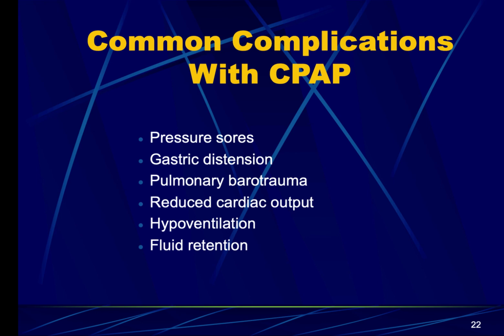And even when it comes to CPAP, remember, we want to reassess. Anytime you do an intervention, you should be reassessing your patient for the pros and cons of that intervention. And that includes adjusting the PEEP, guys. If you go up from 5 to 10, you definitely need to reassess your patient in order to see if that stuff is working.